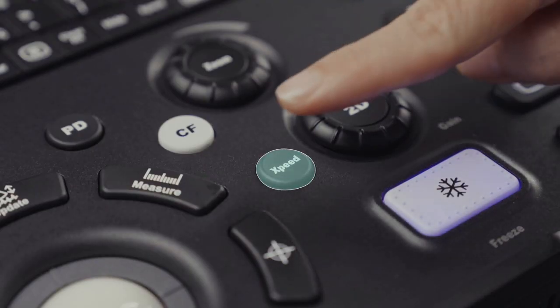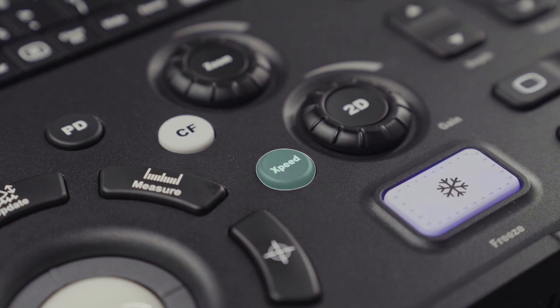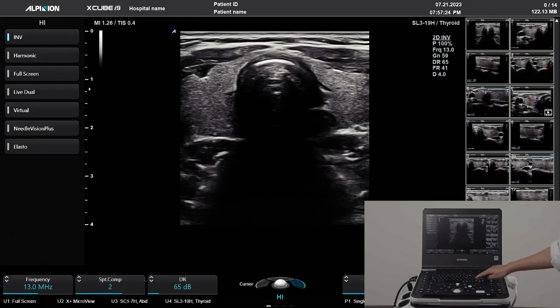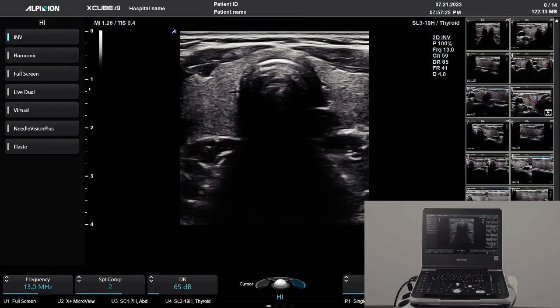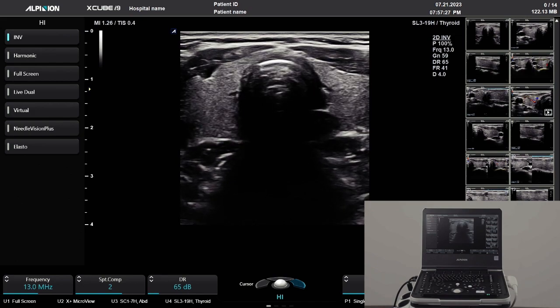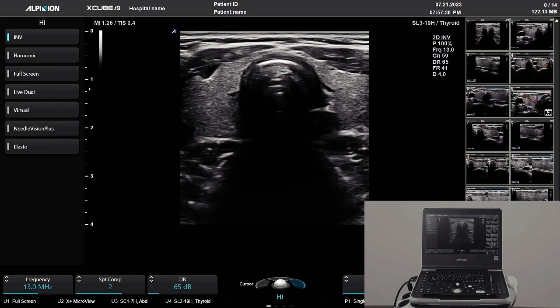X-Speed is an automatic adjustment of the 2D gain and TGC for the current live image. It also adjusts Doppler scale and baseline in Doppler mode.